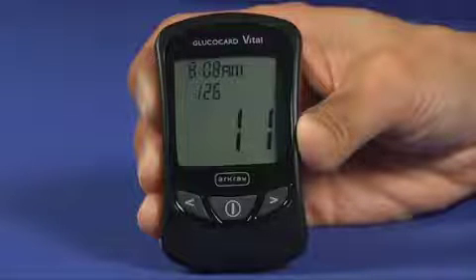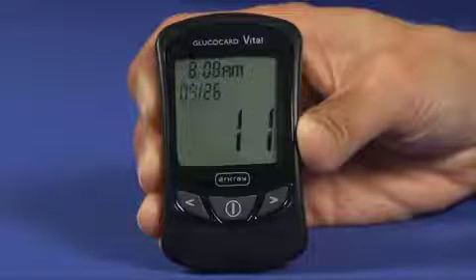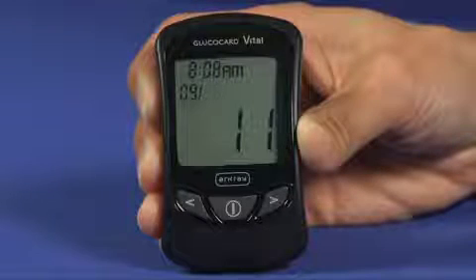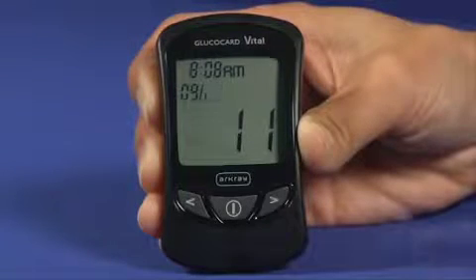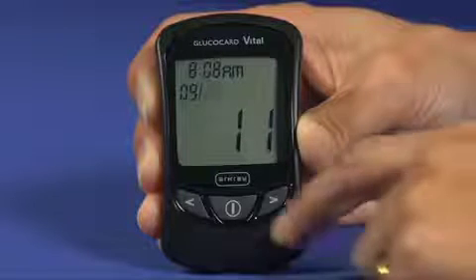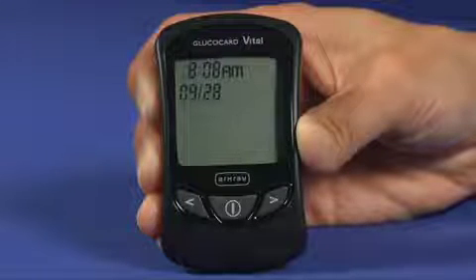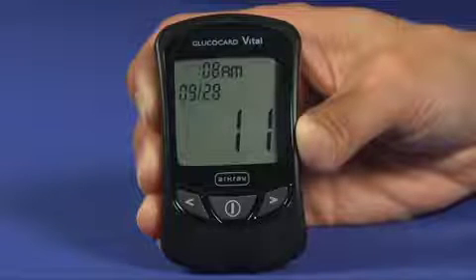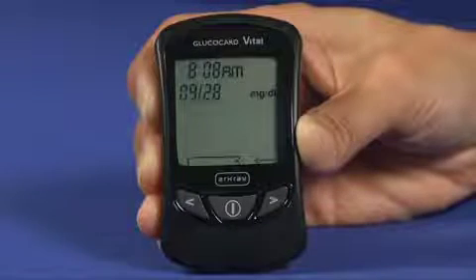The month setting then flashes on the display. Press and release the back or forward buttons to change the month, then press the on-off button to make your selection. The day setting then flashes — adjust with the back or forward buttons and confirm with the on-off button. The year setting then flashes — adjust and confirm the same way. Then press the on-off button for 2 seconds to save the settings and exit the setup mode.